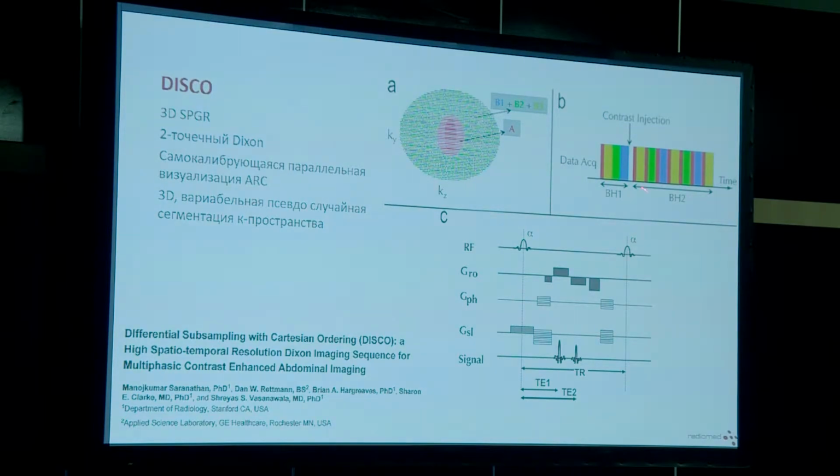After contrast injection, the k-space center is being sampled more frequently. With every sample of the k-space center, the dots of one color are being sampled. Then for the following contrast phases, the views for the colored dots are shared across the phases. That allows a very high temporal resolution parallel to a high spatial resolution.